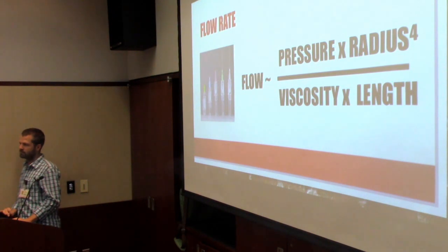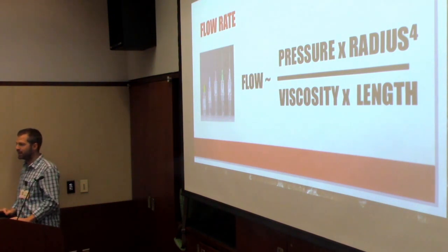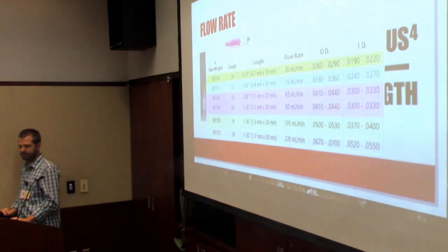But because of that length factor, when the radius to the fourth is certainly a much larger factor, literally, length is relevant in decision making very practically. And the gauge of the triple lumen catheter, each of the little triple lumens is like 20-something to 30-something gauge in general, so they're all tiny tubes. I think they're like 20.